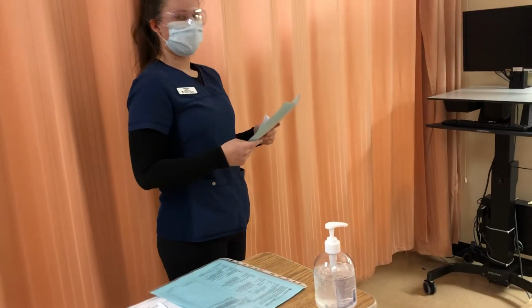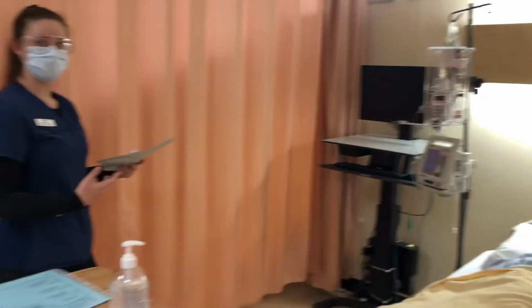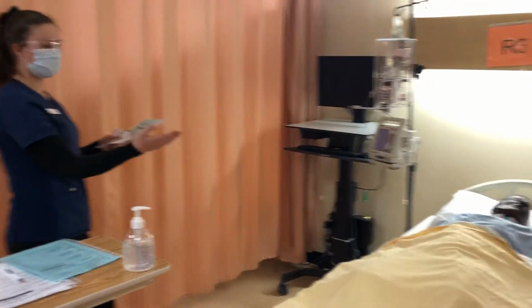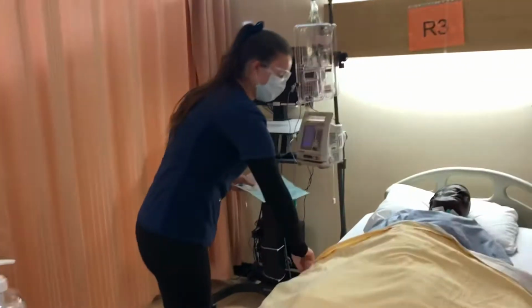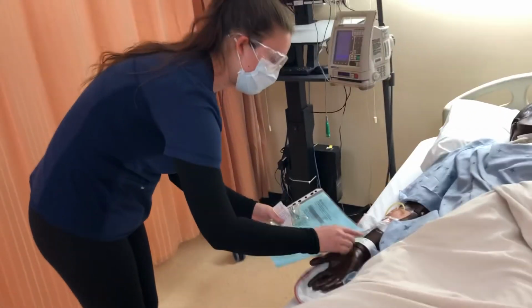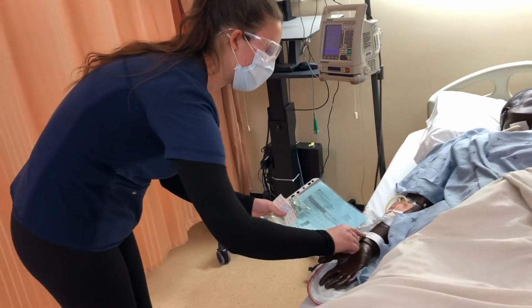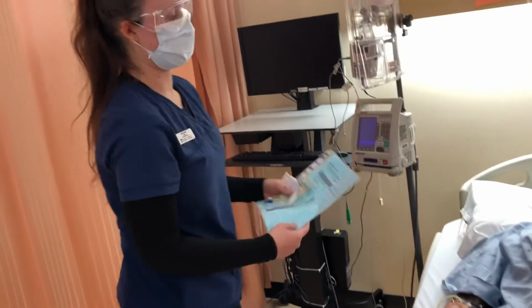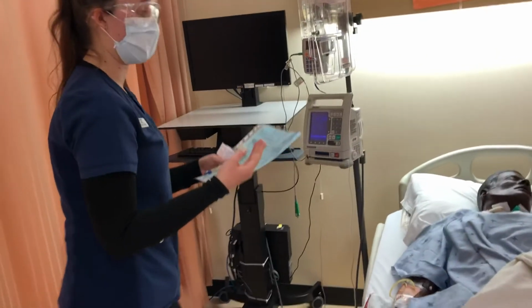Knock on door. Hello, my name is Heather Milan, and I'm a student nurse that's here to administer a medication for you today. So I'm doing an entrance safety check. The patient is not in distress, the call bell's in reach, and there are no hazards within the room. So I'm going to go verify I have the correct patient. Looking at the wristband to my MAR, I'm seeing Marcy Paris Finn, 55 years old with no allergy bracelet. I will now be asking my patient verbally to tell me their first name, last name, birth date, and allergies.